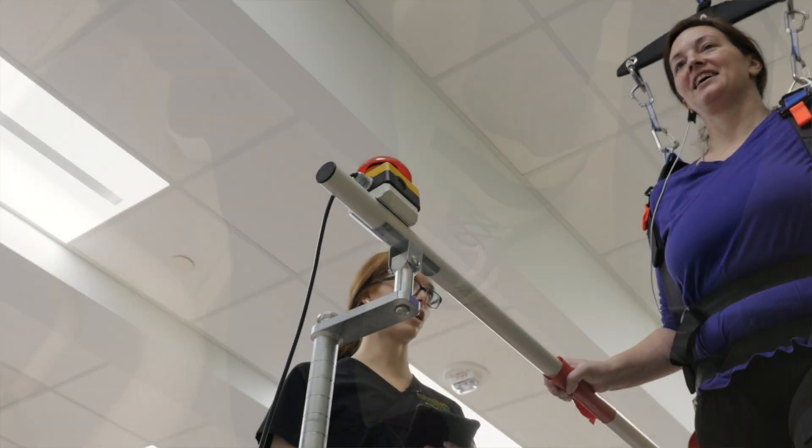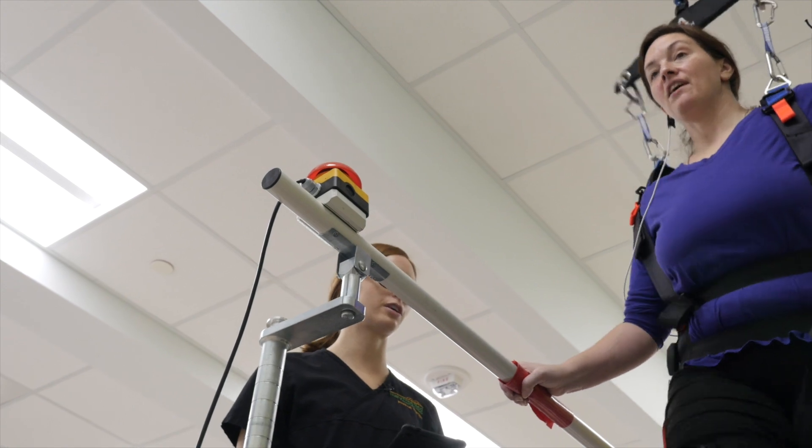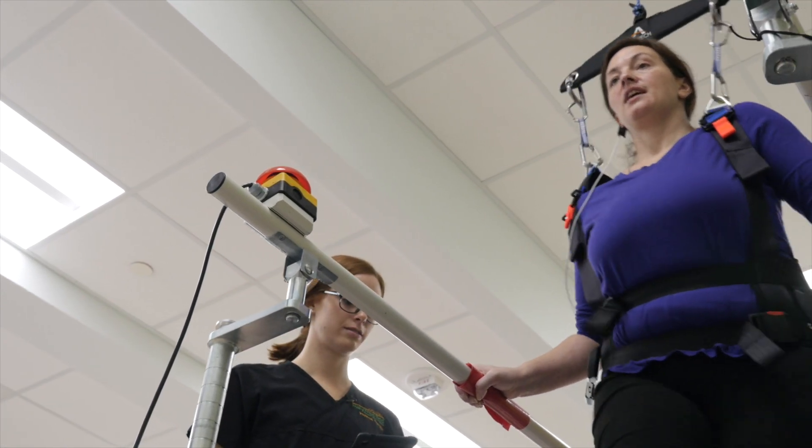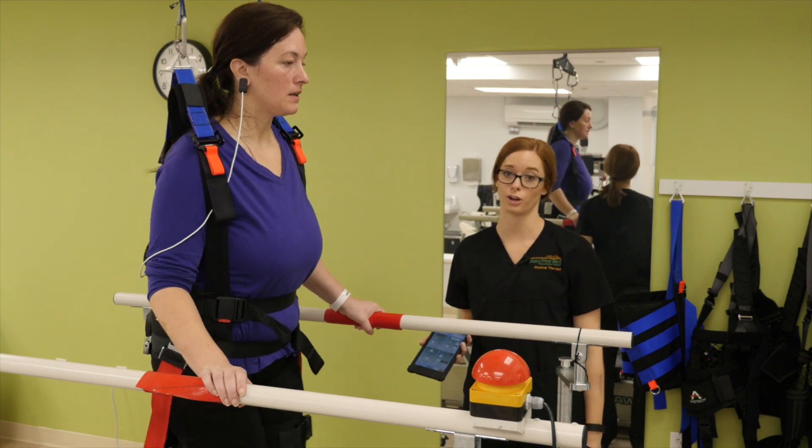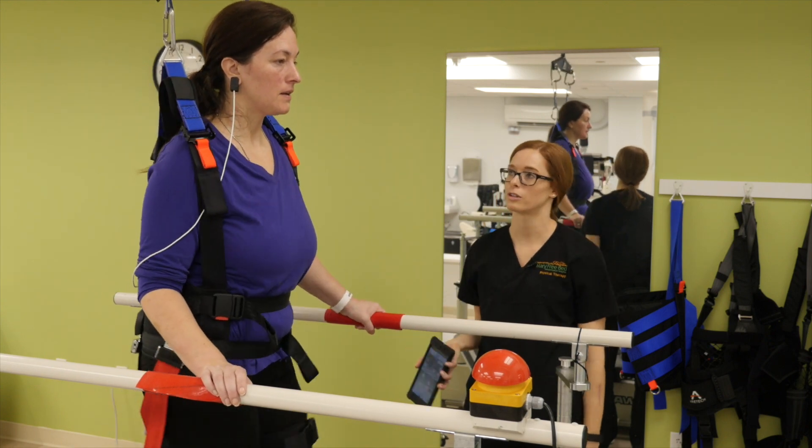I love this because we can get people moving quickly. I think it was huge for Nikki that even in the first week to week and a half she could see where we were going. It just gives me the ability to get people up faster, to work them hard, and I've seen great results with this.